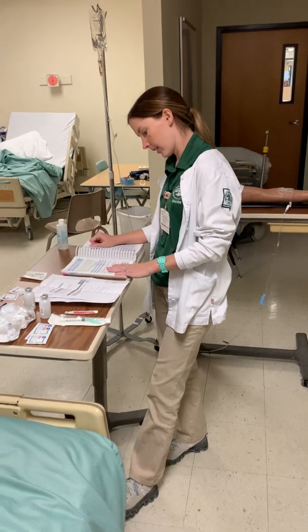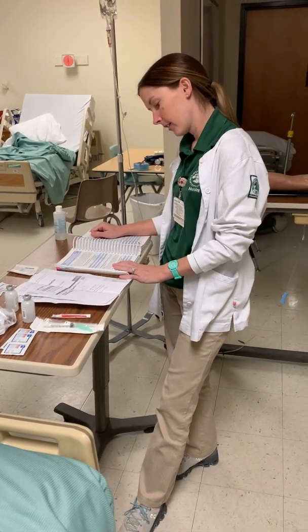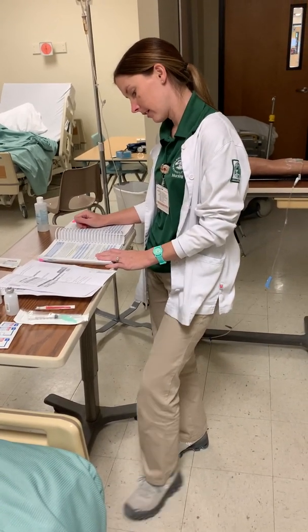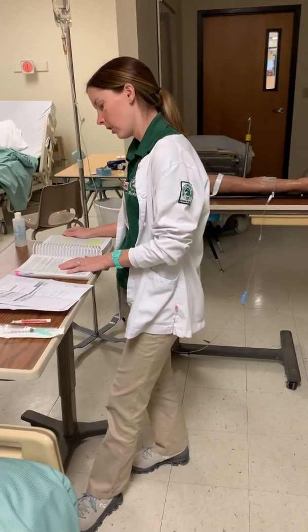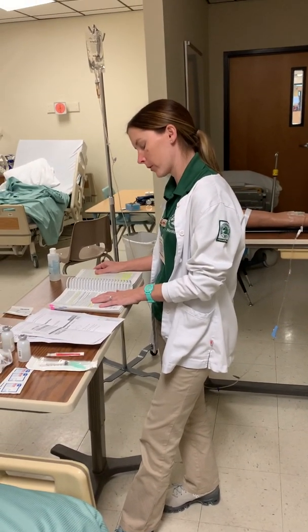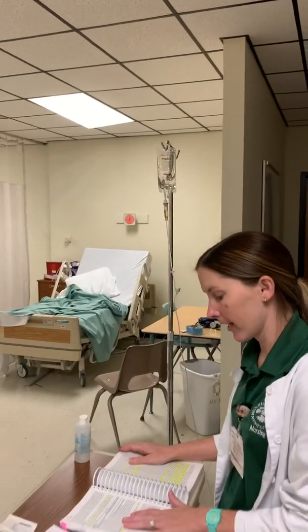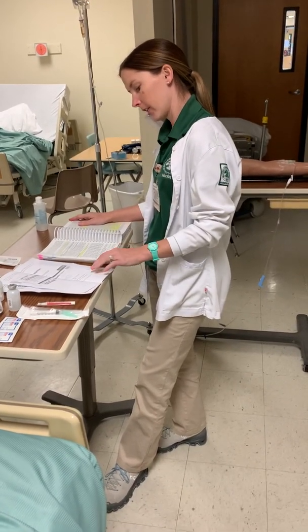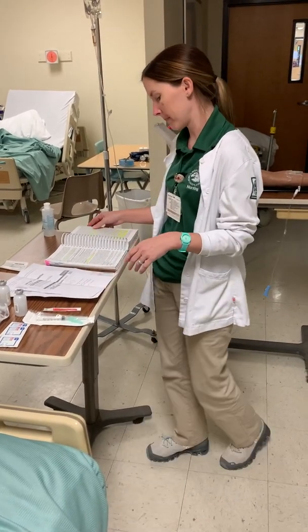The recommended dose says 2.4 to 3.6 micrograms per kilogram per day, given once daily. The dose can be adjusted every 2 weeks according to clinical response. And then for dilution, like I said, it can be given undiluted, or each 1 milliliter can be diluted in 4 milliliters of sterile water, normal saline, or D5W. And we have D5W hanging today, so we're compatible with what's hanging. The rate of administration, each single dose needs to be given over a minimum of 5 minutes. So we're going to be giving it over 5 minutes.